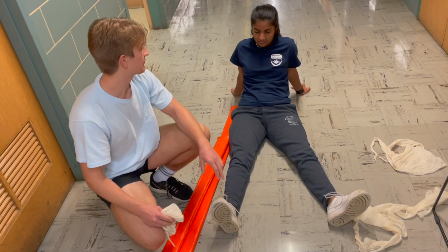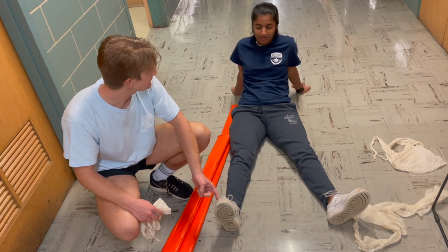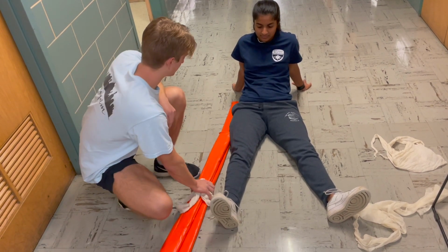and then we would get the patient to close their eyes and tell me what toe I'm touching. Pinky. Yep, again, easier without a shoe on. And then can you wiggle your toes for me? Great. Now we'll begin splinting.